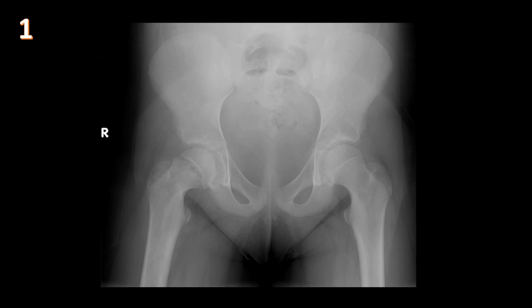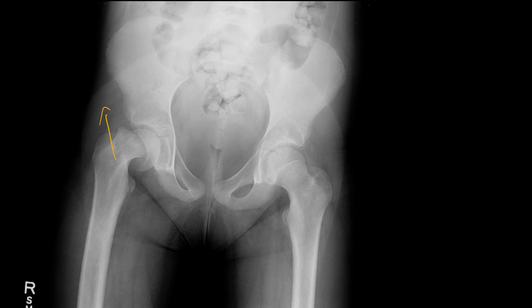First case: we have an AP view of a skeletally immature patient and we see widening of the proximal femoral growth plate on the right side compared to the left, with minimal slippage — the femoral neck is going superior in relation to the femoral head, which is still articulating with the acetabulum. Follow-up shows progressive slippage of the femoral neck with persistent widening of the growth plate.